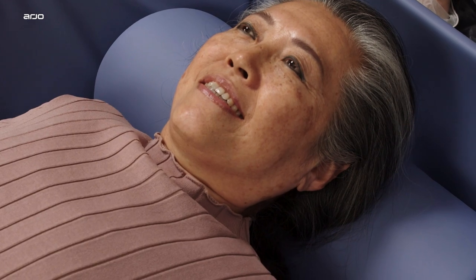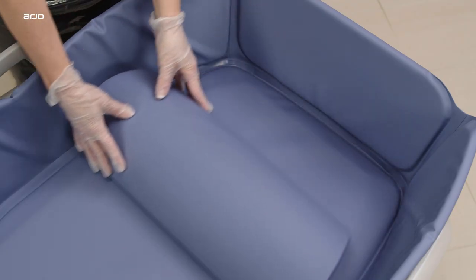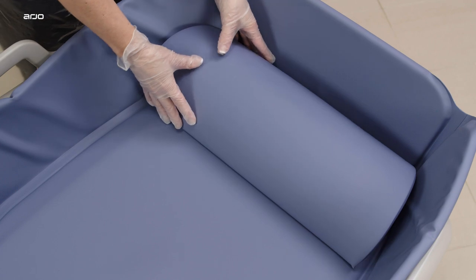A head pillow can be used to enhance the comfort level of the resident. The head pillow is shaped to fit into the head end of the mattress and provide warmth and comfort for the resident.